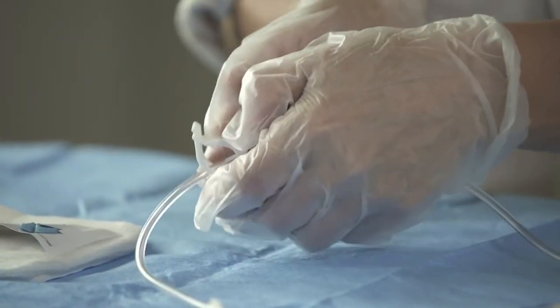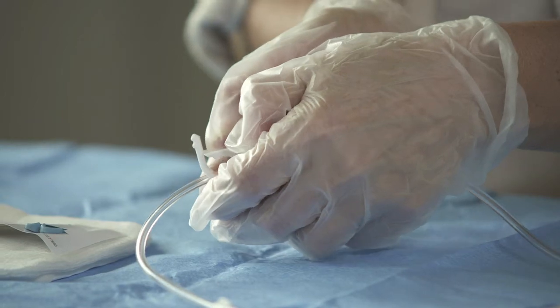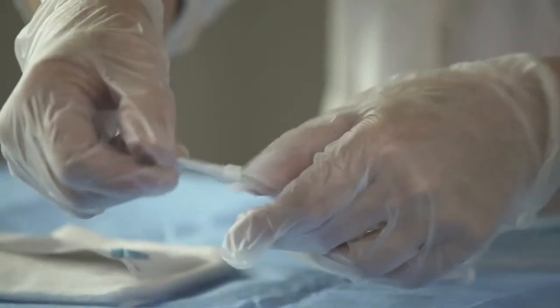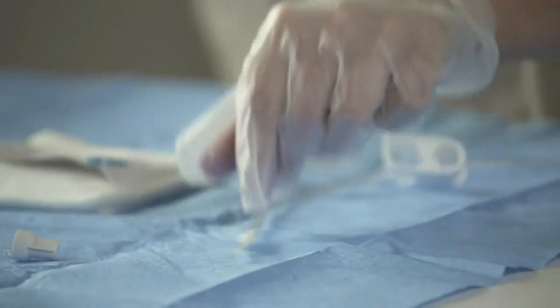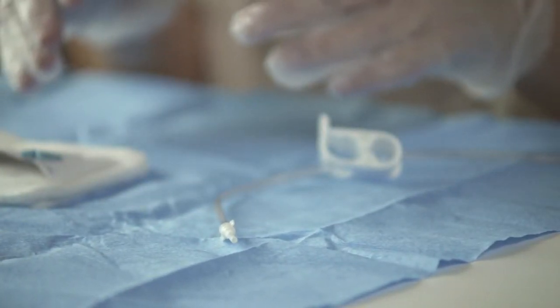Tightly squeeze the clamp on the drainage line to completely close it. This clamp prevents drainage from starting until you're ready. Pick up the drainage line near the tip, twist the cover, and pull the cover off. Set the exposed tip back on the sterile blue wrapping.